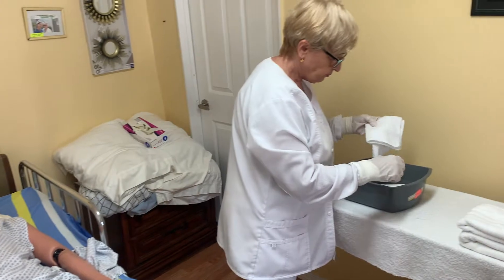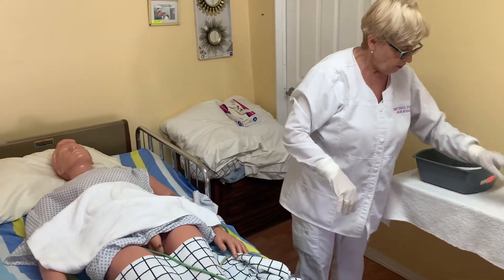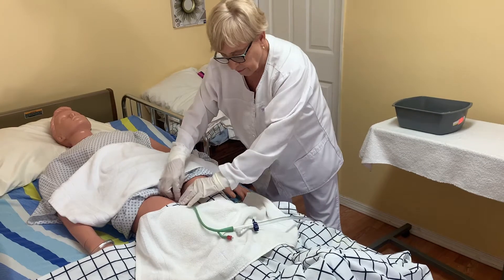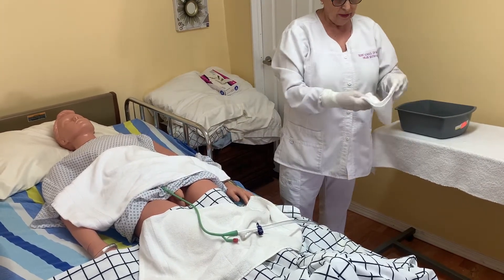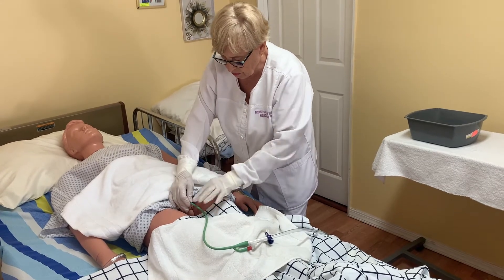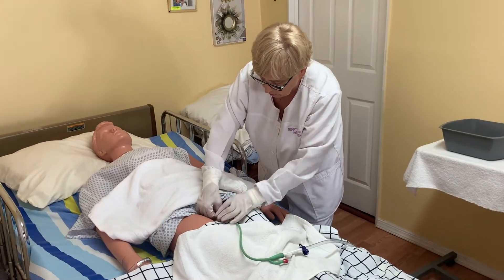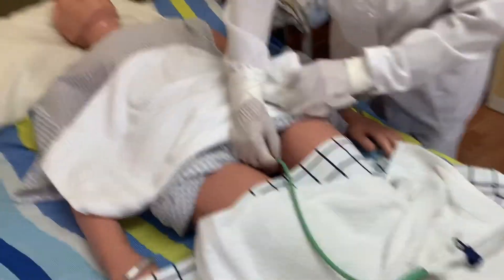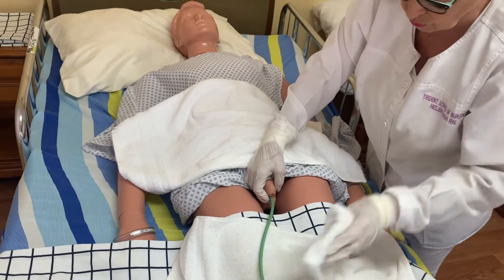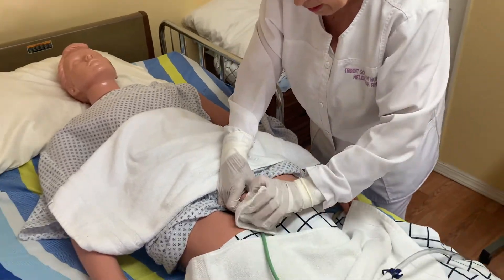How do I clean? I use the two towels — one to cover here and the other to cover here to keep the patient warm. I put the soap in the water, warm it up, and clean like this. You put your finger here to hold the catheter in place, because you want to wash from in to out — they say four inches, but you can wash as far as you need. You can turn to the other side and do three strokes.